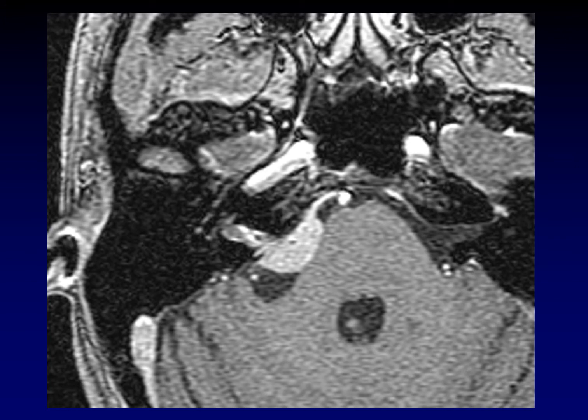Compare that last slide to this one. This is a classic meningioma of the cerebellopontine angle. Notice how the widest part of the tumor is the part that is up against the bone. That's what we mean by a broad-based lesion. Look at this piece of enhancement extending along the dura of the clivus. That's what we mean by a dural tail. In fact, you can almost imagine this looking like a little mouse with a tail. That's the dural tail that we're looking for in meningioma. The enhancement pattern here is not perfectly uniform. There are a couple of little dots of lesser or greater enhancement. But as masses in the brain go, this is a pretty homogeneous enhancement pattern. So we'll call that homogeneous.